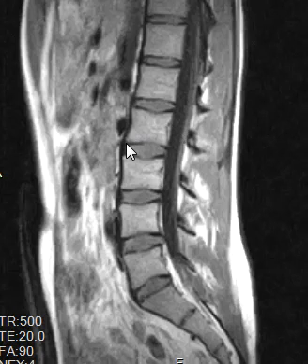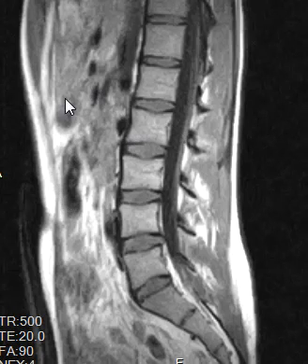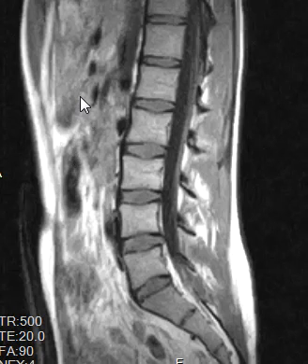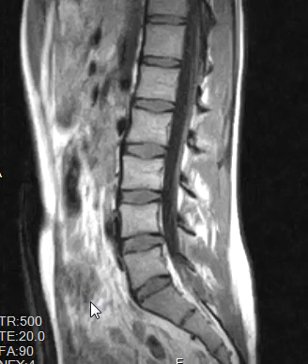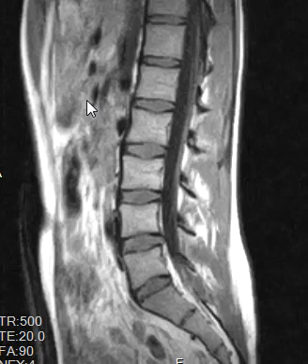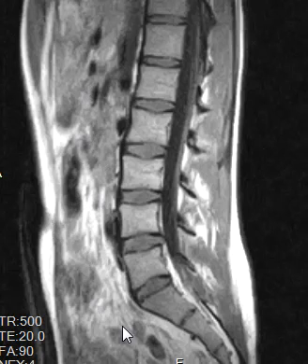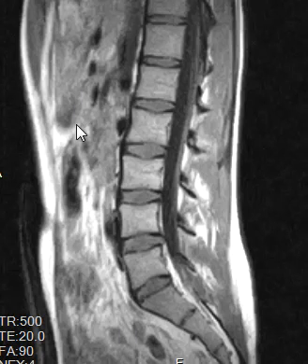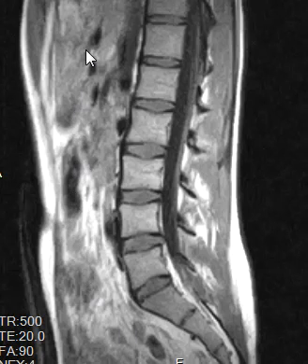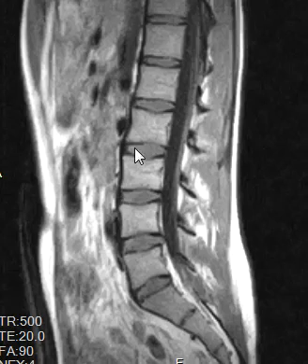We're going to start with a side view where we're going to see the abdomen off to the left of the screen. This is the abdomen up top, pelvis down below, belly button's about right here, and this is all the abdominal contents — bowel loops, abdominal fat, and blood vessels.